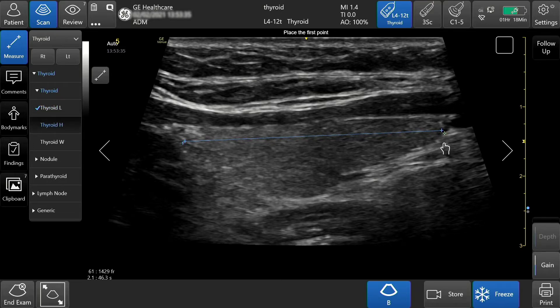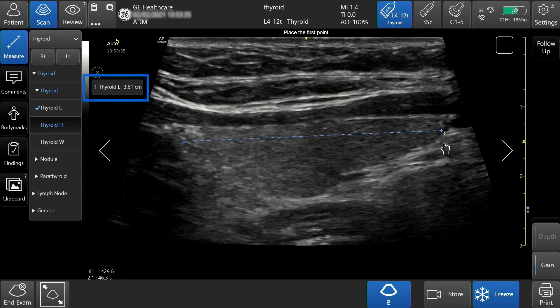If the measurement does not display, tap the measurement icon that appears on the left hand side of your touch screen and the thyroid length will be displayed.